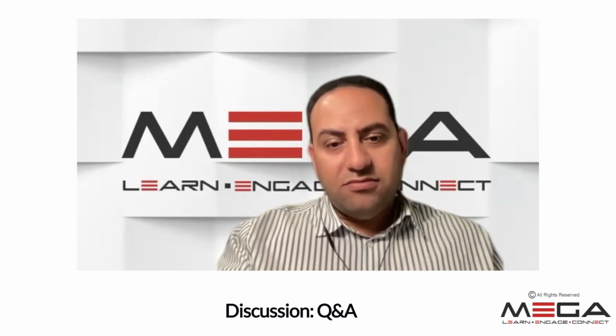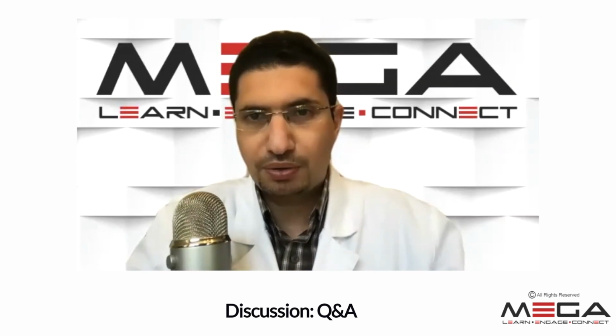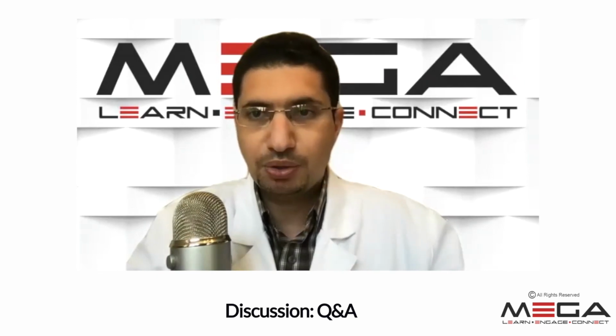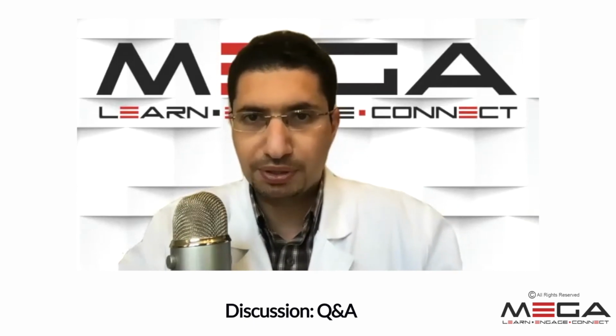Yeah, that's a very good question. Essentially, a point of care echo does not have good sensitivity nor specificity. So you really cannot rule out a PE based on transthoracic echo. When would you use it? CTPA remains the standard. CTPA is how you would really diagnose a massive or a submassive or any degree of pulmonary embolism.